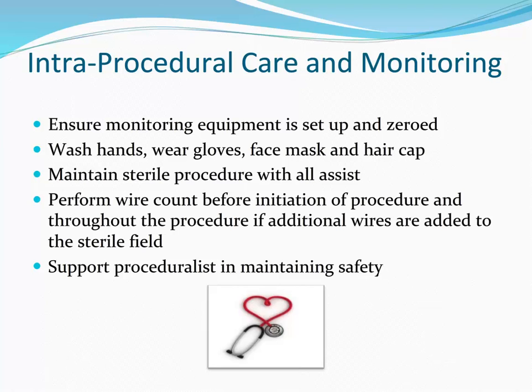Be sure to perform a wire count before the initiation of the procedure. One wire is prepackaged with the standard CVL kit. Remember to perform the count again whenever an additional wire is added to the sterile field. This is a collaborative effort initiated by nursing to maintain safety.